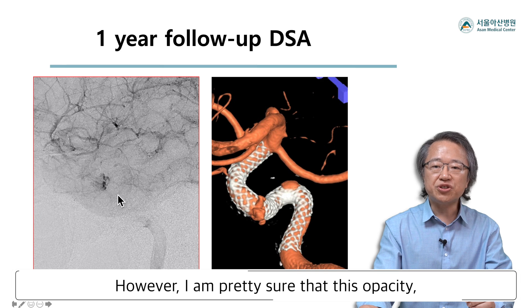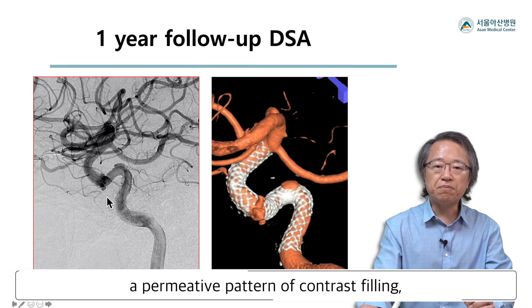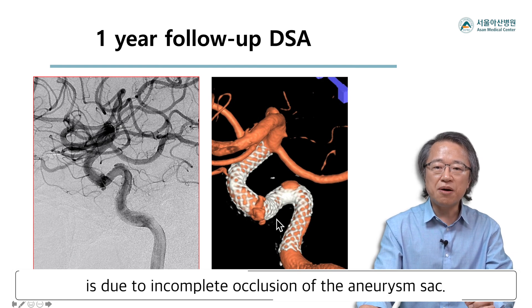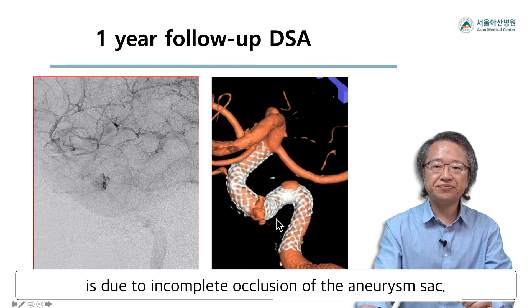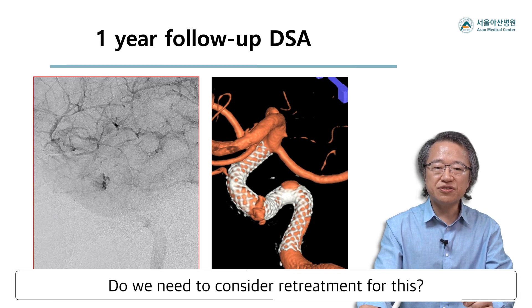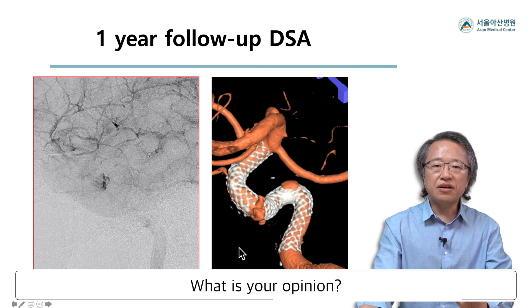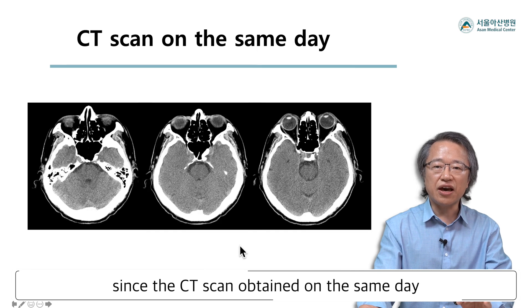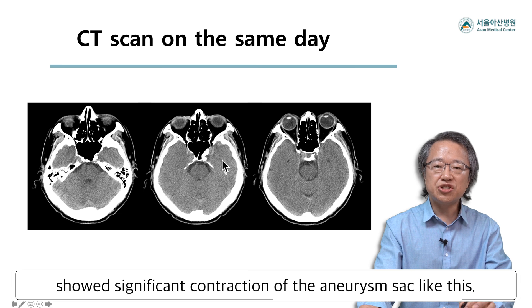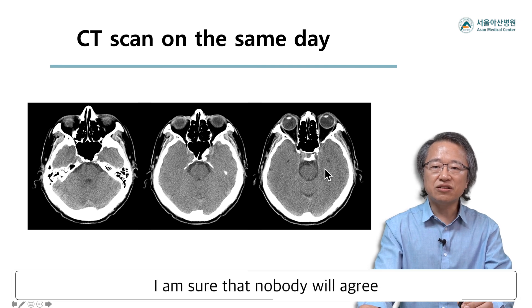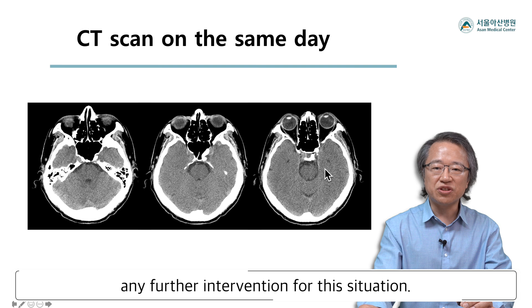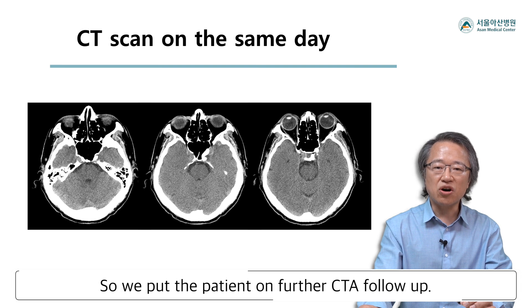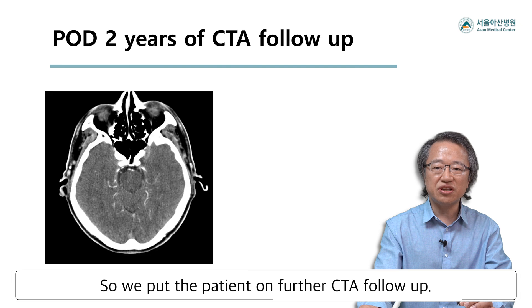However, I am pretty sure that this permeative pattern of contrast filling is due to incomplete occlusion of the aneurysm sac. Do we need to consider retreatment for this? The decision was not that difficult, since the CT scan obtained on the same day showed significant contraction of the aneurysm sac. I am sure nobody would agree to any further intervention in this situation, so we put the patient on further CTA follow-up.